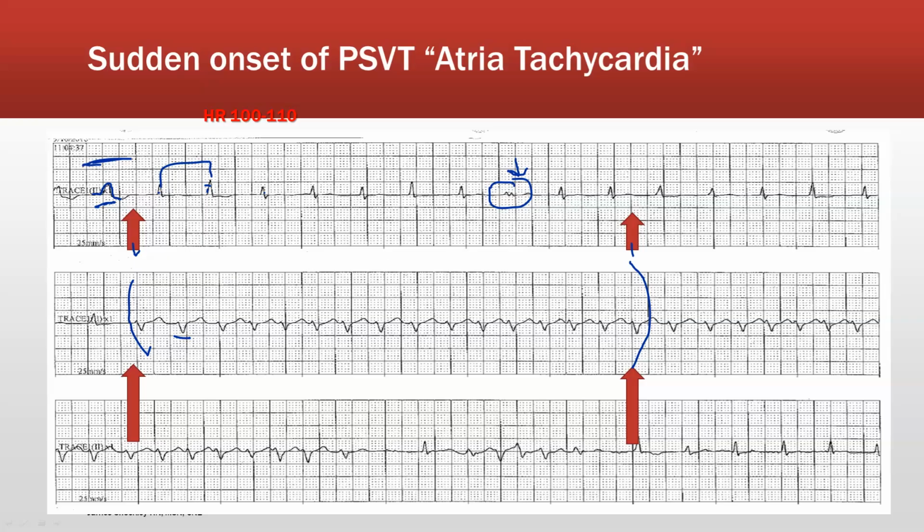I don't want you folks to get confused if you were to see something like this. It's just basically how the machine is monitoring what is going on in your atria at any specific time. So it doesn't necessarily mean something nefarious. It just means instead of viewing it from one direction, we're viewing it now from a different direction.